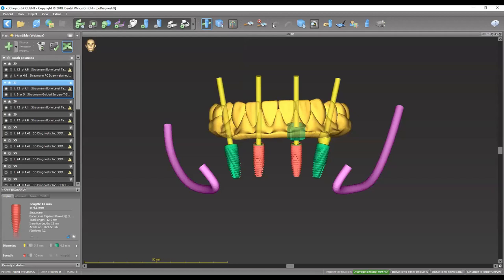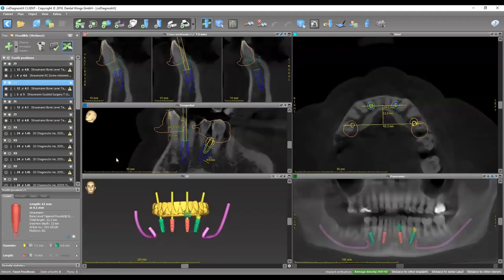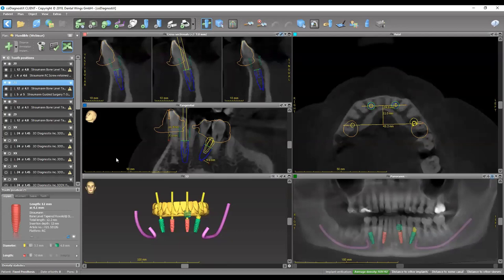Another question: How do you align the wax-up in the program? We design the wax-up using the patient's occlusion and then import it into the software, making sure it's aligned perfectly with the patient's upper arch. We use the opposing arch to make sure the virtual wax-up looks good, and the final outcome is a class one prosthesis without any problems. Regarding a follow-up about measuring 30 degrees from the maxillary cuspids — let's move on to the maxilla again to elaborate.